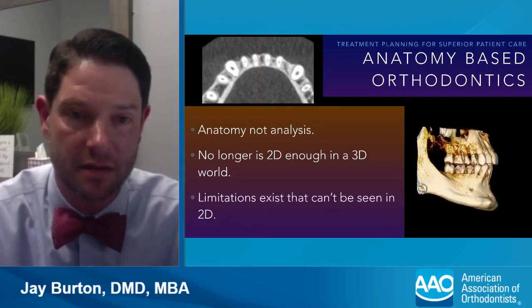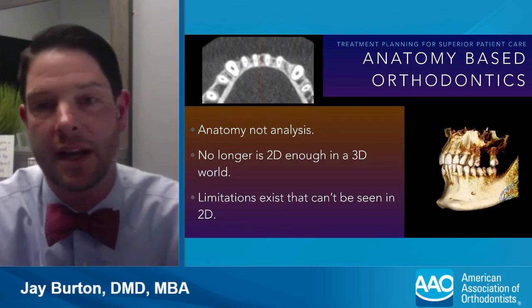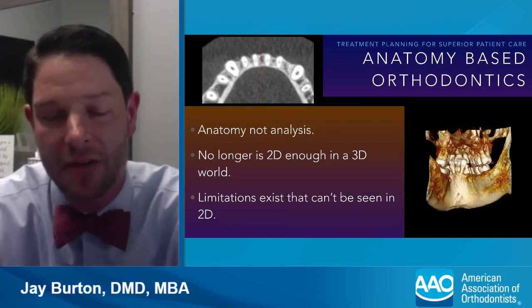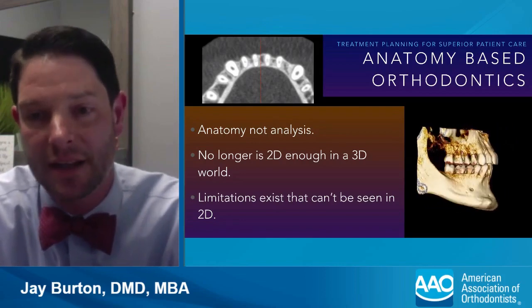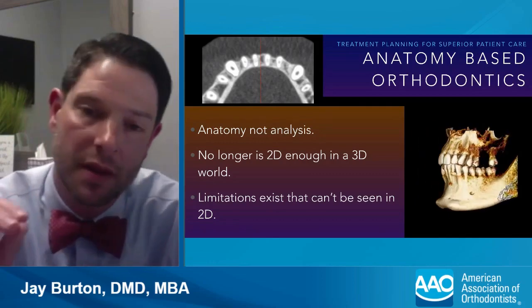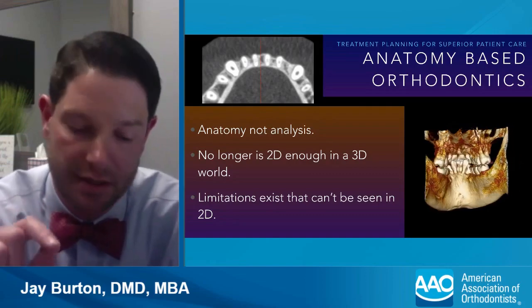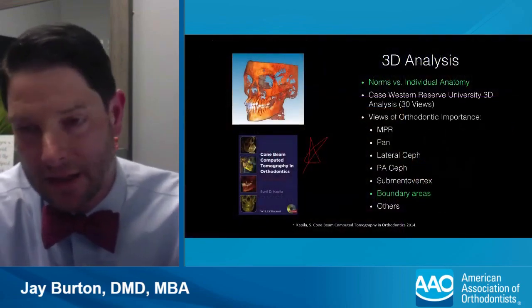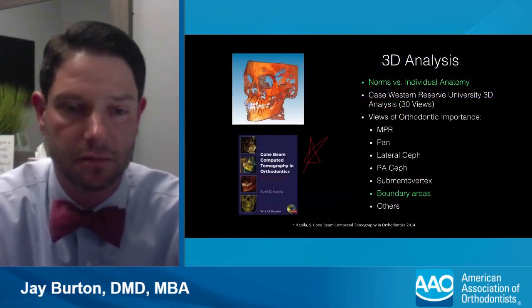Limitations exist. Your patient has limitations. It's just a matter that you can't see them in 2D, and many times, without that knowledge, you will choose mechanics that will violate their limits. With 3D, it lets you know what the limitations are prior to determining what treatment needs to be done.